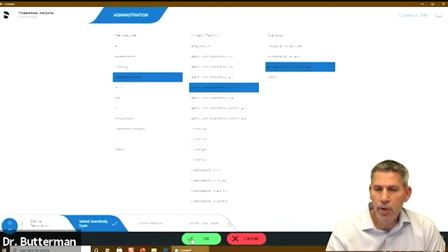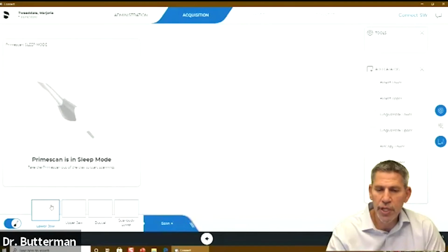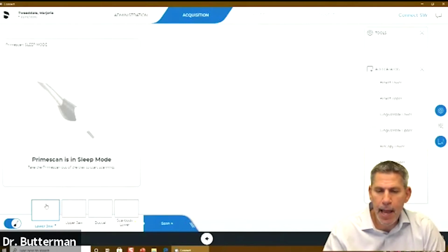When it comes to our scans, I'm going to need a couple of them. I'll let it go through and I'll just walk you through the imaging. And again, this is in real time. I sped up just a teeny bit for the scan body, but I just want you to see in real time how it looks to scan and how difficult it is to scan.